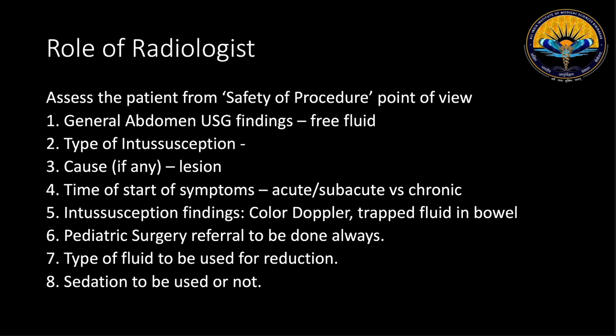So what is the role of radiologist? So as a radiologist, we have to assess the patient from safety of procedure point of view. And to do that, we have to keep in mind these following 8 points. So the first is the general abdomen ultrasound findings.